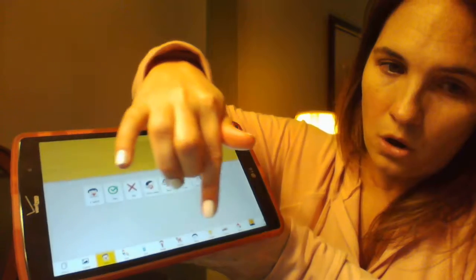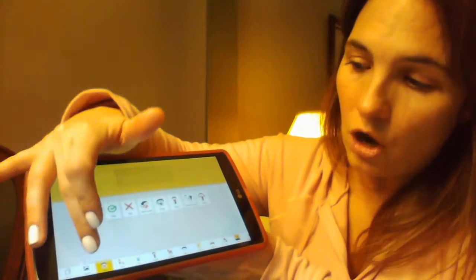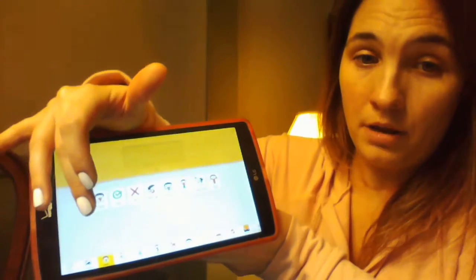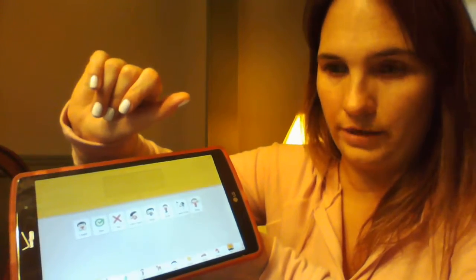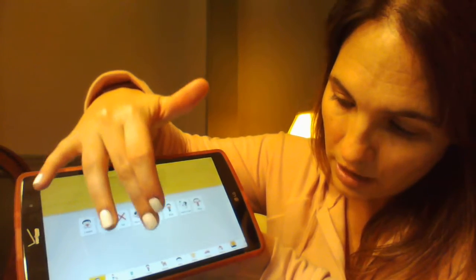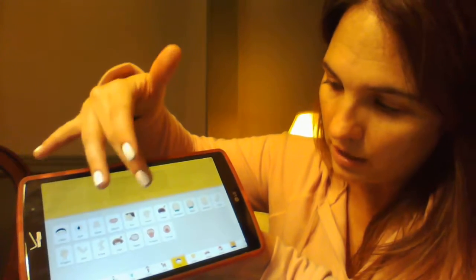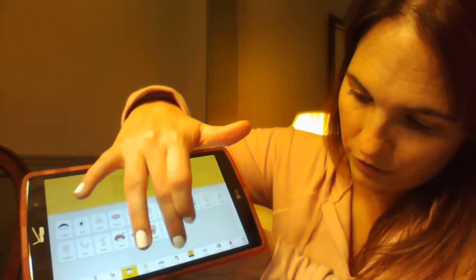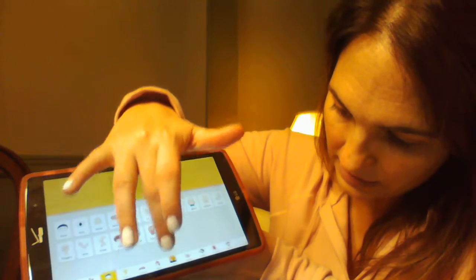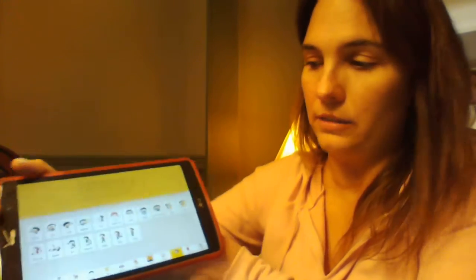So on the bottom of this app here, there's a ton of categories, and that is where the pictures are located. So you have history, original, and that section is where you can find all of the pictures and cards that you have uploaded yourself, because you can add your own pictures and phrases as well. There's toys, food, people, animals, body, and the body section has things like eyes, ears, nose, hands, stomach. There's a clothes section, vehicle. You slide over, you see places, time, feelings, actions, relations, and questions. So these are all things the students can ask.